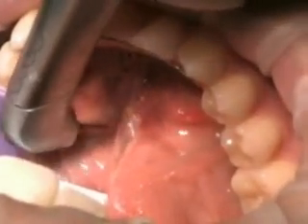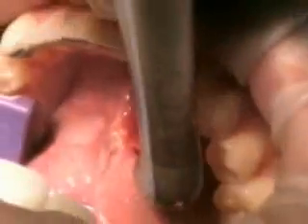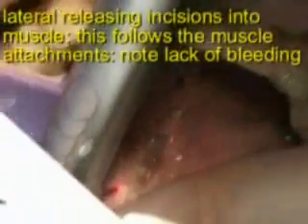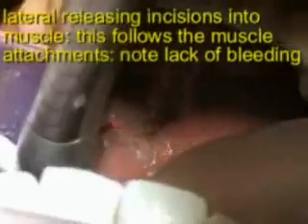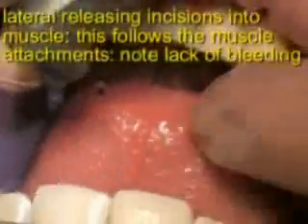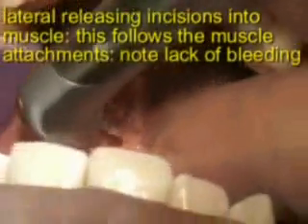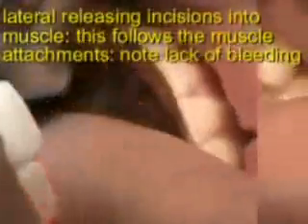Now you can see this laser — I'm just wiping this connective tissue, this fibrous tissue, in a bloodless, beautiful incision. I'm very slowly freeing up the tissue. Here I am up on the tip of the tongue now, going into this band of fibrous connective tissue. The tip of his tongue could only reach to the incisal edge of the lower teeth — he could not touch his lip with his tongue. He was that limited.